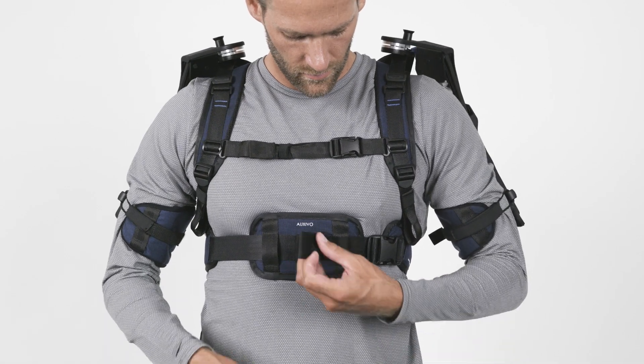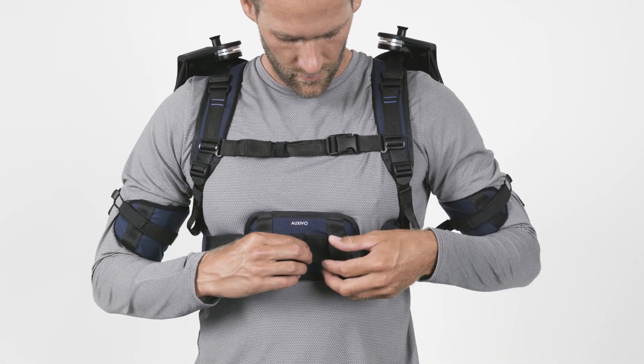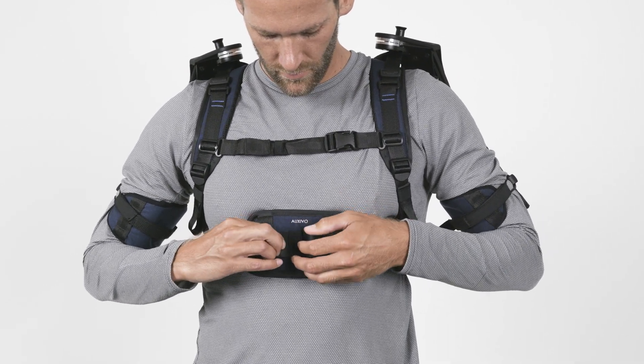Once you have adjusted all straps, secure all loose band ends with the loops provided. Otherwise, they could get stuck somewhere.